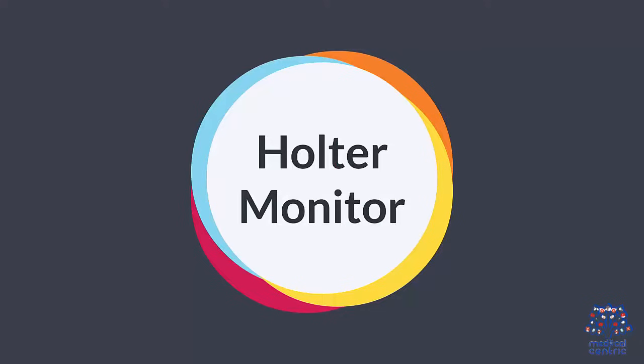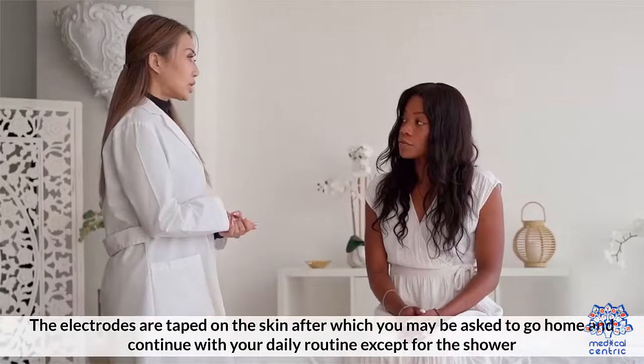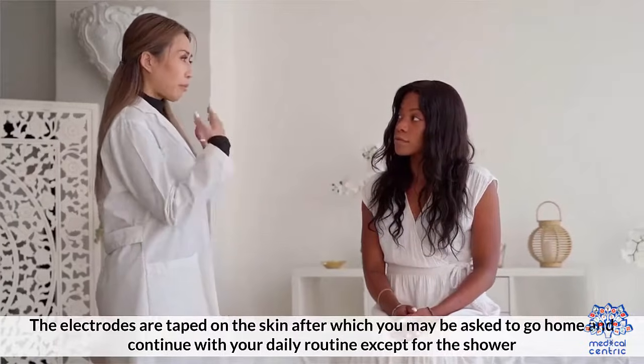Holter Monitor: The Holter monitor is a type of electrocardiogram used to monitor the electrical activity of the heart continuously for a period of 24 hours or longer. The electrodes are taped on the skin, after which you may be asked to go home and continue your daily routine, except for showering.